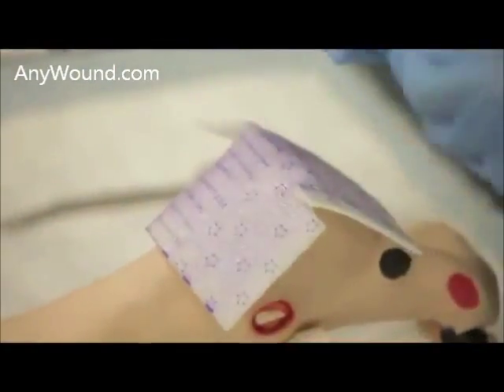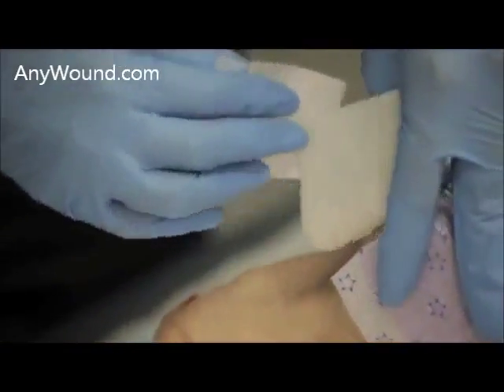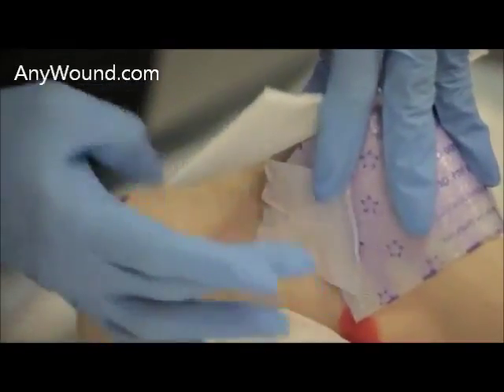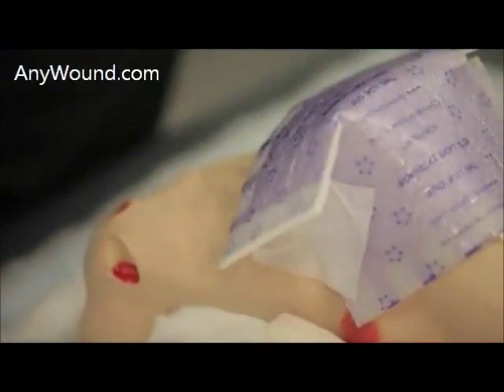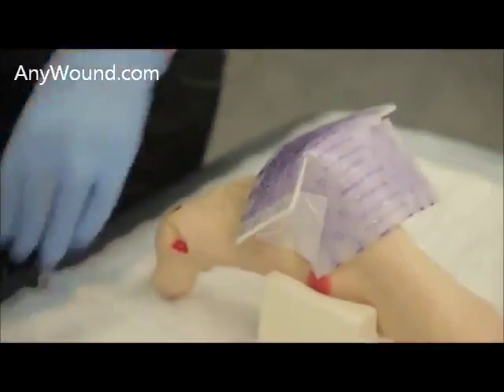The other way of doing this is by cutting a slit, securing this side down to the patient, and then folding this over and securing the other side down.